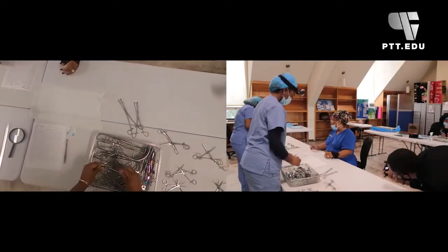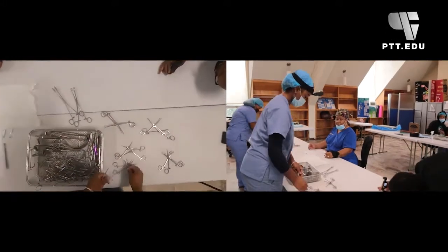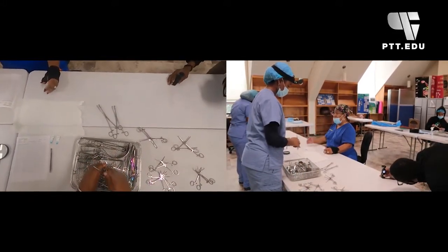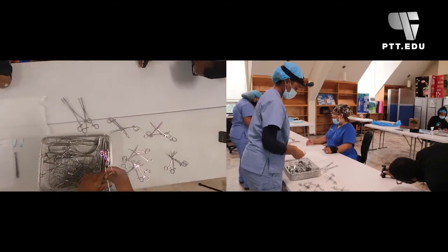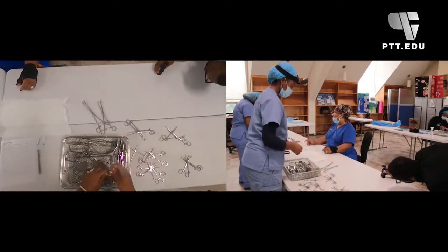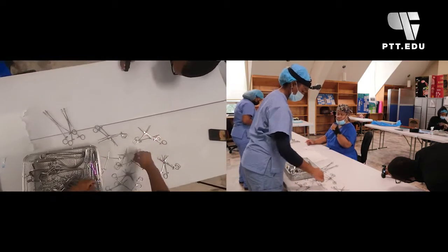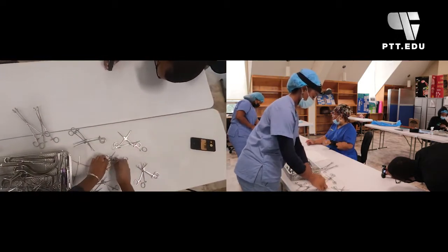Whenever you dump instruments out onto tables, you always separate the instrumentation that you have in your baskets, piece by piece. This is also a good time for you to inspect your instruments to make sure they are in functioning order.